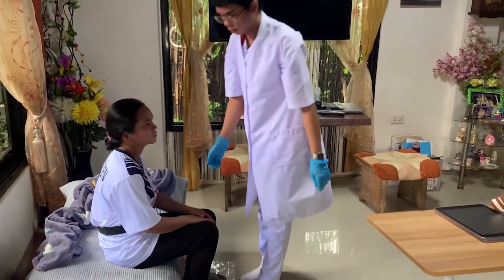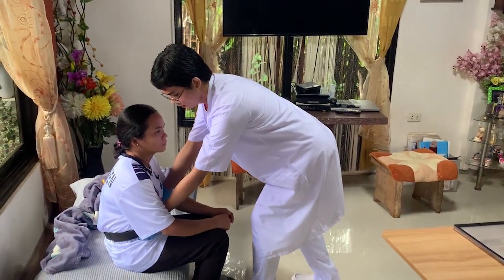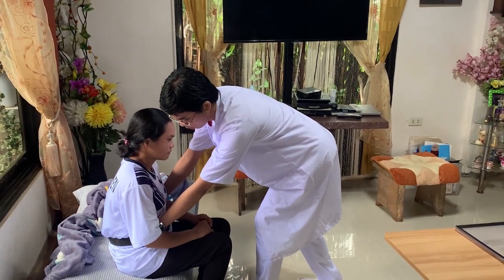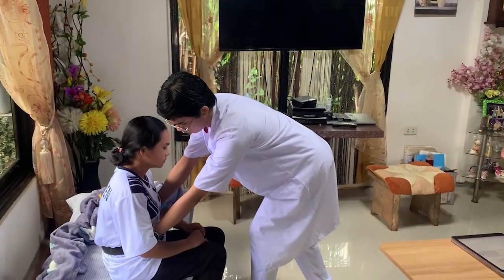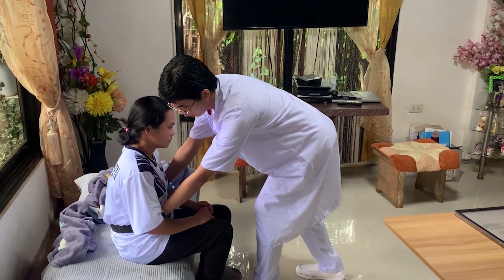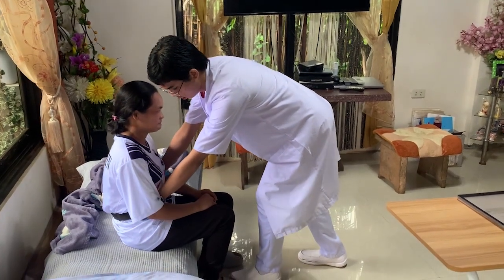After that, we're going to assist the client by standing in front of the client, grasping each side of the gait belt, keeping back straight and knees bent. Use of the gait belt will prevent injury to the nurse and also to the client. While holding the belt, gently rock back and forth 3 times. On the 3rd time, pull the client into a standing position. The action provides momentum to help the client into the standing position.